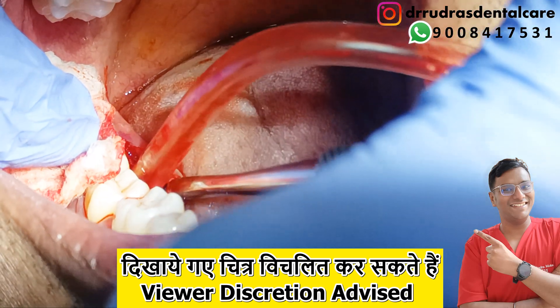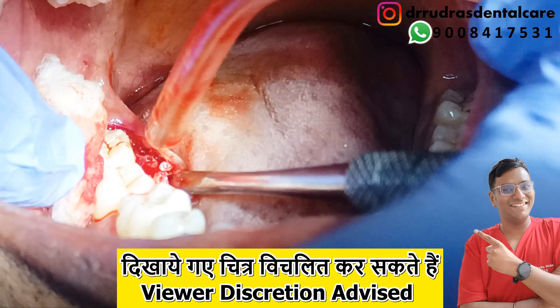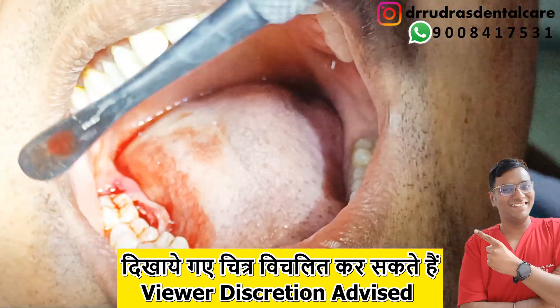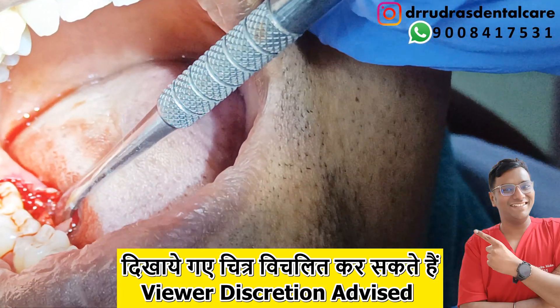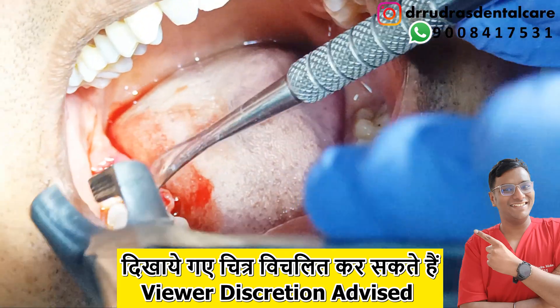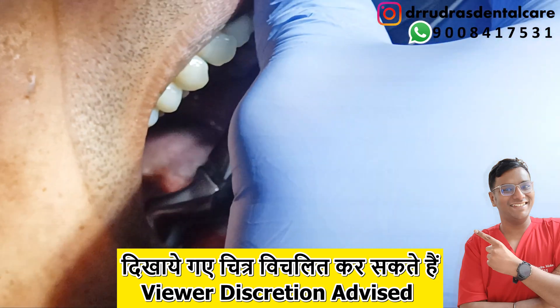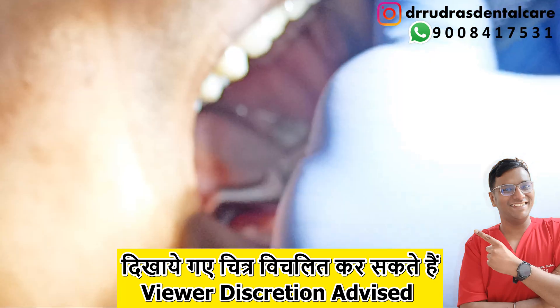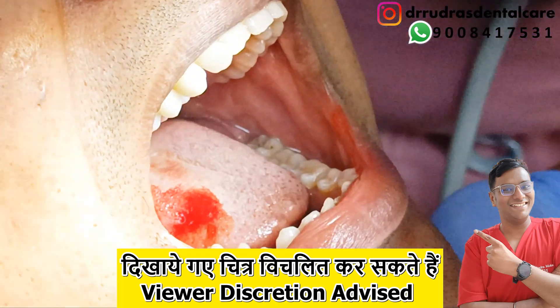In the next few images you can see the sharp bony spicule that has been causing pain to the patient. We make sure that it is removed and shaved off with the help of instruments like bone rongeurs or bone files. It is finely filed out, the rough edge of the bone is smoothened, and then sutures are placed to stitch the wound.